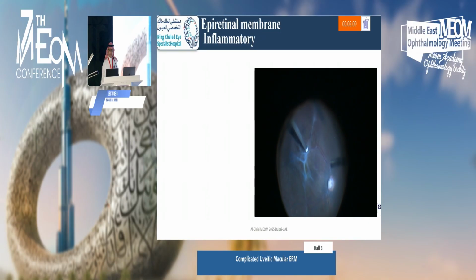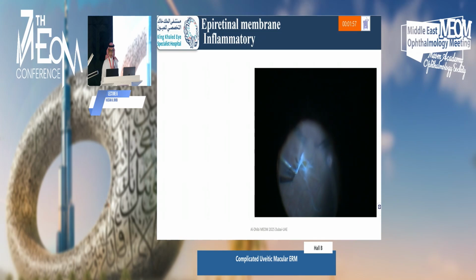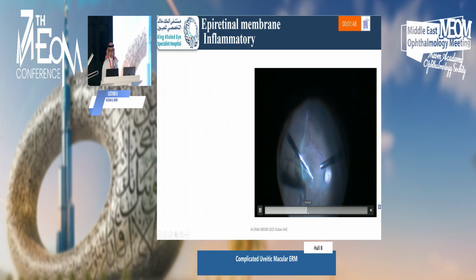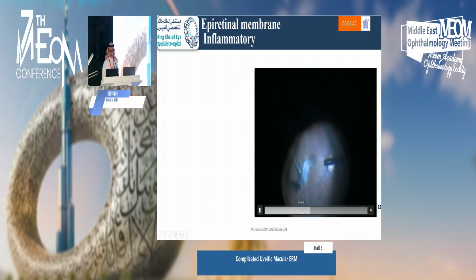Some of these epiretinal membranes are intraretinal rather than just on the surface of the retina. So starting with this, playing around in a circumferential preference, like you see here, getting in. And my heart was beating a lot at this time. What I have to remember is that this is the only eye, with already ischemic retina from the previous attacks of intermediate uveitis and vasculitis.